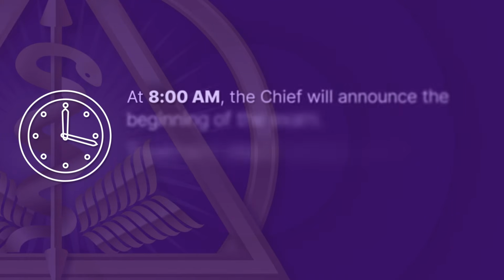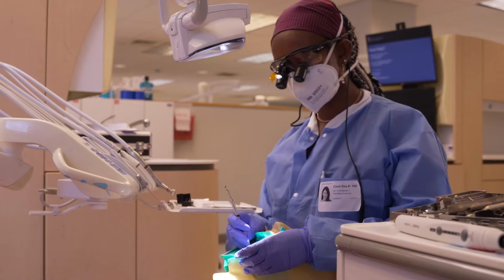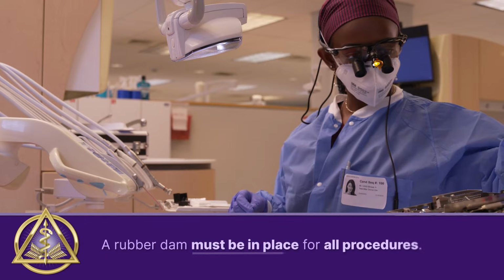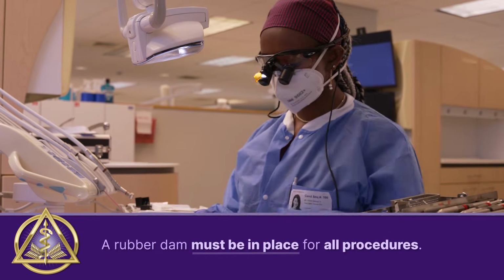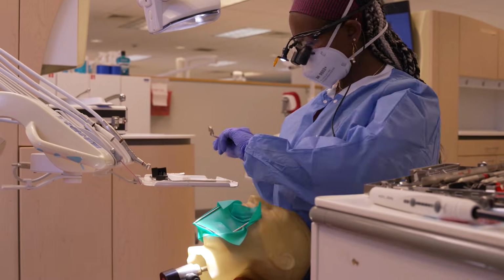The chief will announce the beginning of the exam at 8 a.m. Once the exam begins, all treatment must comply with CDC, OSHA infection control requirements. You may now begin treatment. A rubber dam must be in place for all procedures. You may remove the dam to check the occlusion of your restoration before submitting it for grading.